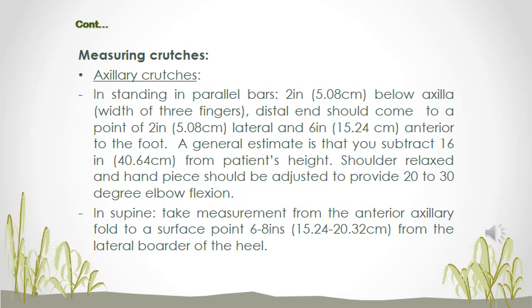A general estimate that you can also use is to subtract 40 centimeters from the patient's height. So you can use this as well: height minus 40 centimeters is how high the axillary crutch should be. That's a general estimate, but the shoulders should be relaxed and the hand piece should be adjusted to provide 20 to 30 degrees of elbow flexion.